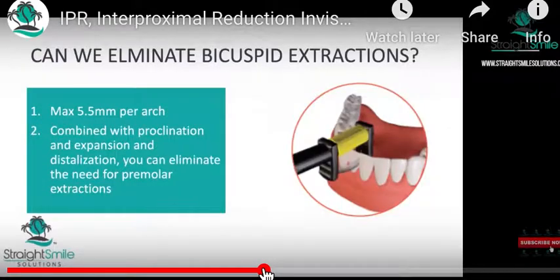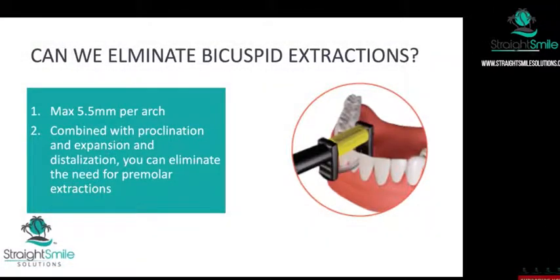Okay. In the video that we're recommending you go to, at gpwebinar.com, we are going to be going over the Garrison Fit Strip system. This is the system that's available in the United States. It's a great system. It's probably my favorite. There are other ones like Contact EZ, and there are ones that are on rotary, slow speeds, high speeds.